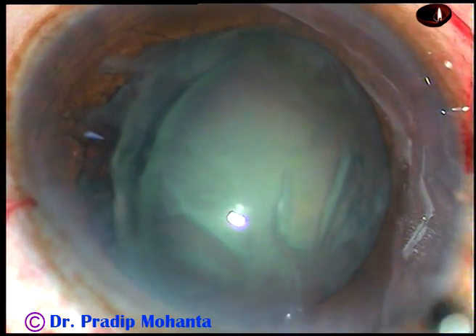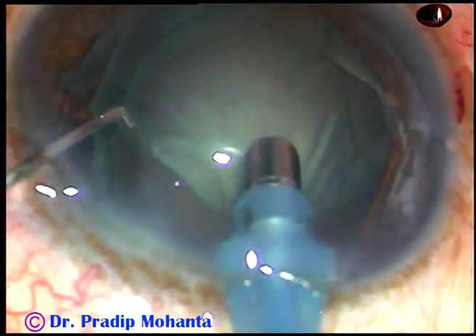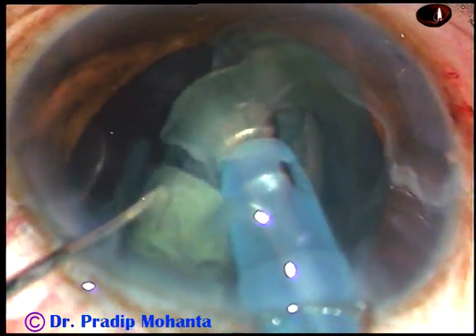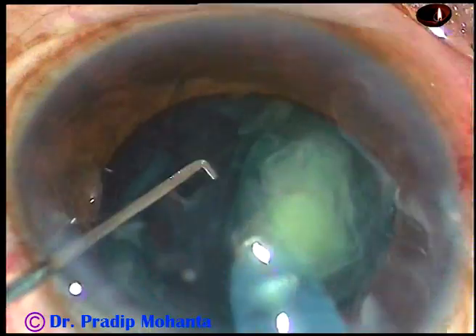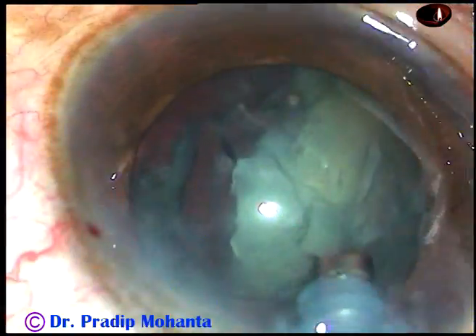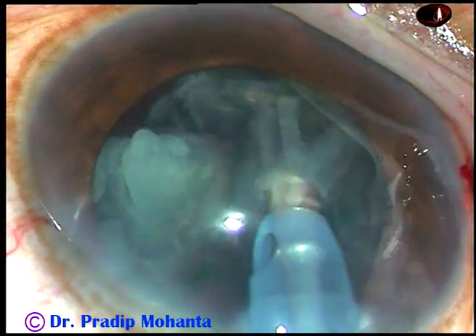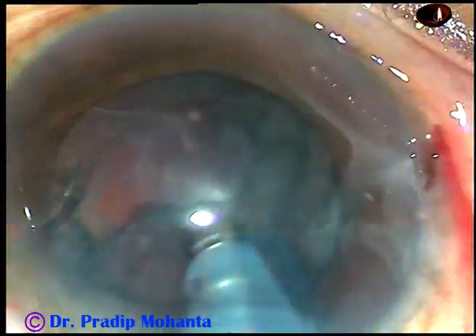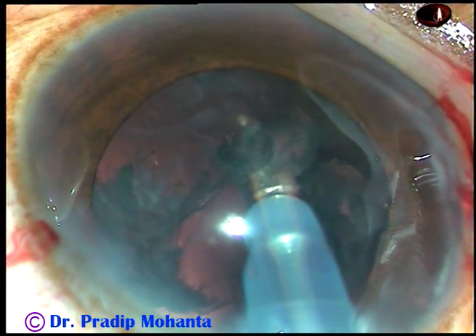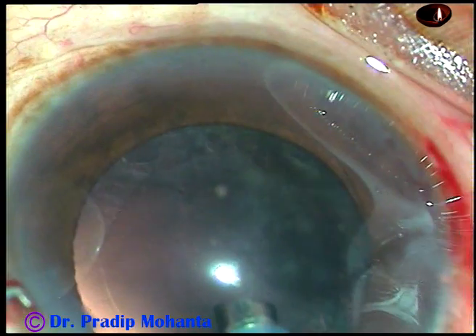This is lens tilt. Lens tilt technique is being employed in this case. I am going to place the phaco tip on the anterior surface and the chopper goes on the posterior surface — see how beautifully you can crack the nucleus. Your phaco tip is always at the plane of the anterior capsule, though a part of the lens mass is in the supracapsular area. There is always a gap between the corneal endothelium and the lens mass. Endothelial protection is very good and there is no chance of posterior capsular rent with this technique. And this is completion of nucleus management.